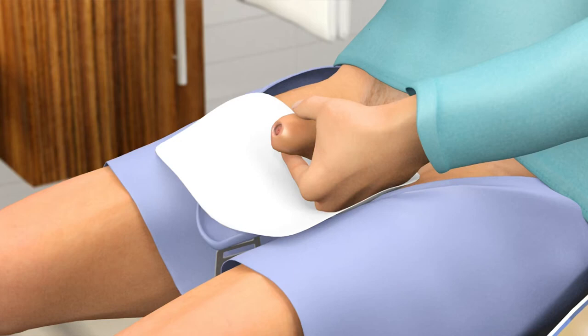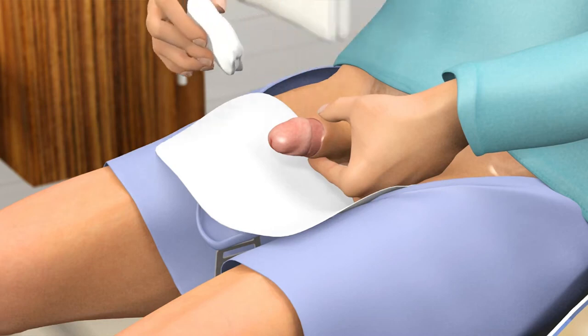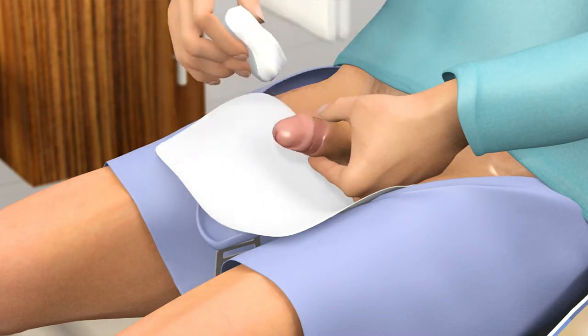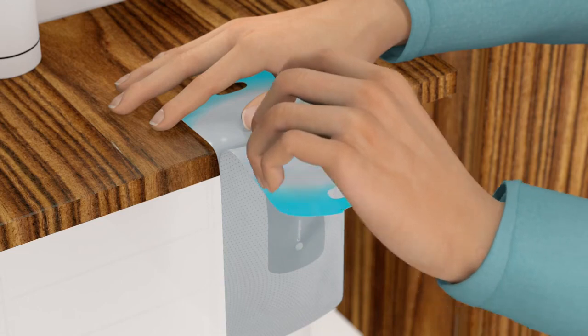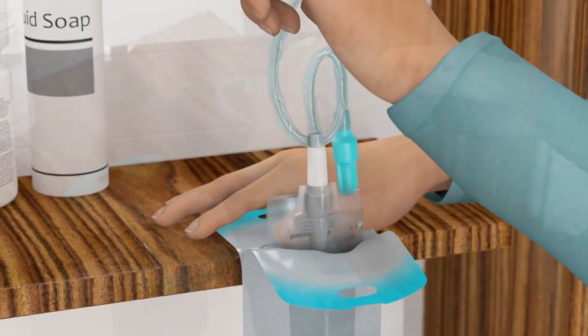To prevent pushing bacteria into the urethra and bladder when you use the catheter, you must first clean the head of your penis properly. Gently pull the foreskin back and wash the head of the penis with water and soap. Use each wipe only once. Take the catheter out of the packaging and unfold the bag.